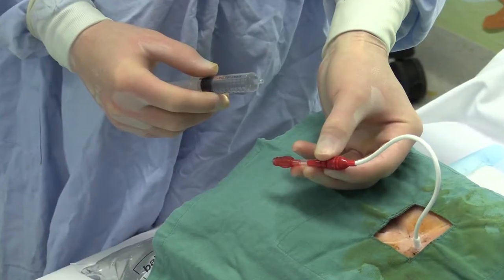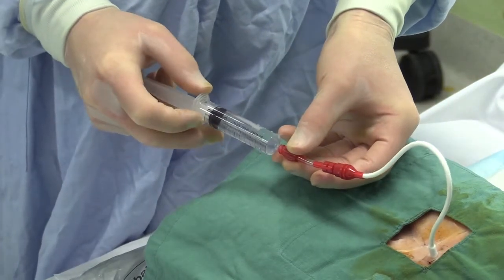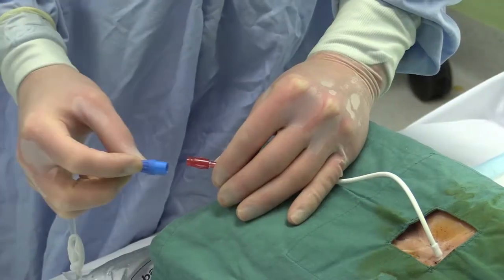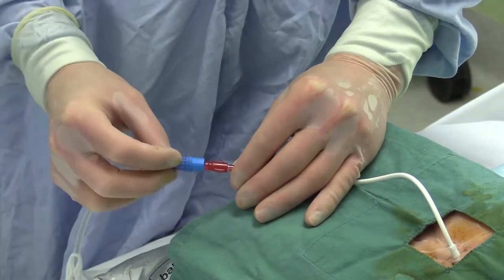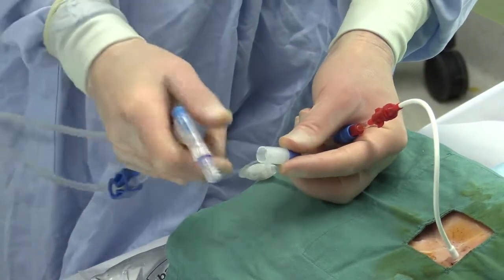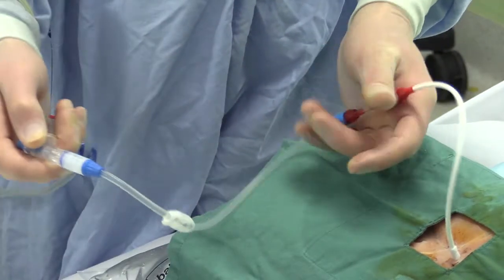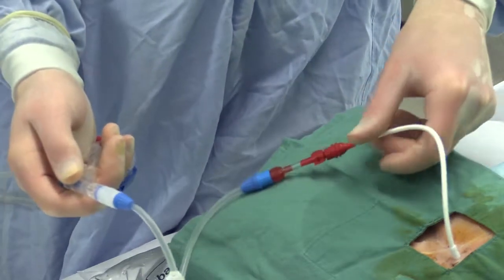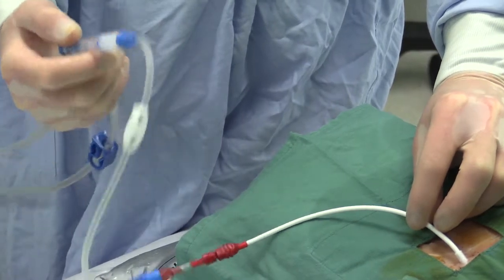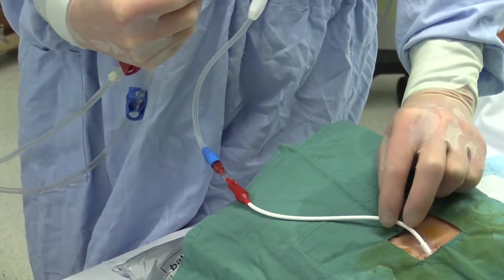So once the adapter is securely in position, the entire catheter is gently flushed with 10 mL of normal saline. Once it's been flushed, a pre-primed adapter is then connected and the system attached to the administration set in a sterile fashion. A test run is then performed to ensure that fluid runs freely into the peritoneal cavity and also drains freely from the pelvis.